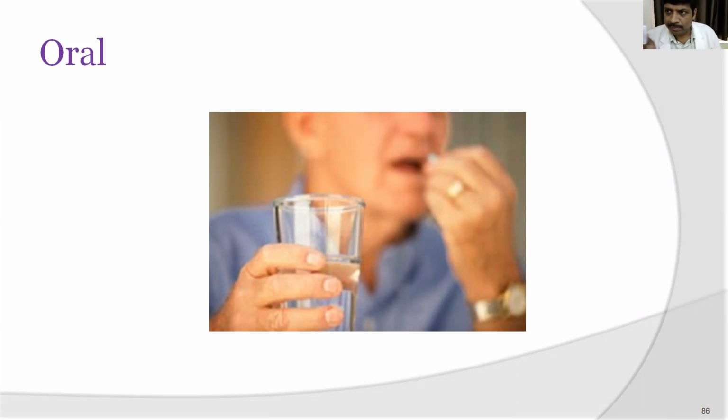This is like an ampule. This is known as an ampule. Okay. Here I don't have a vial. Okay, yeah, I have the vial. So what is a vial and what is an ampule? This is a vial and this is an ampule. Vial, we have a cap. We have to break it open, and then we can put the syringe inside. And the powder is there inside this one. So this is powder medicament for injection.